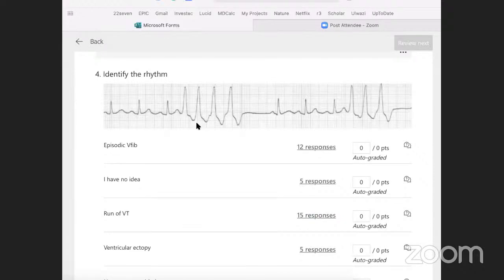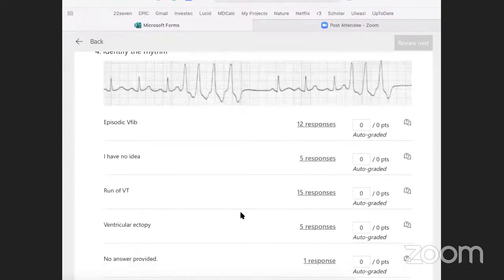And this is quite concerning. Usually if you have an acute coronary syndrome, STEMI, or myocardial infarction, when you reperfuse that part of the heart, you do get this irritable myocardium that gives these runs of VT. So episodic VFib, it would be a lot more awkward, as if someone was scribbling over the screen.